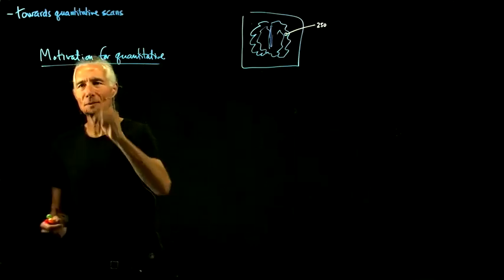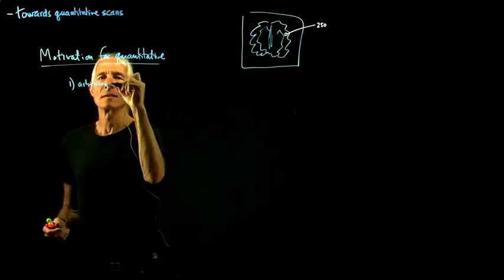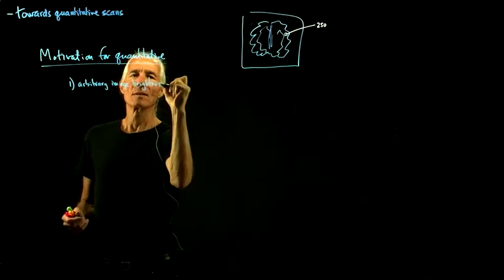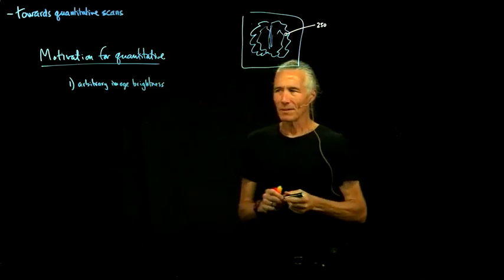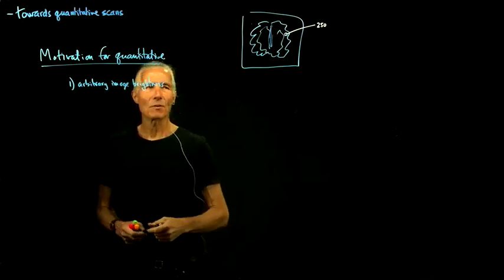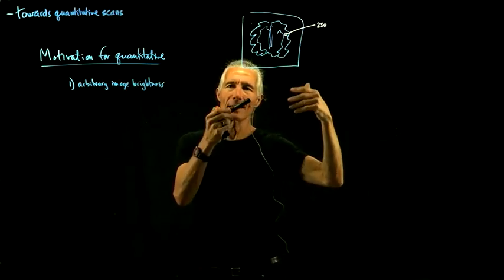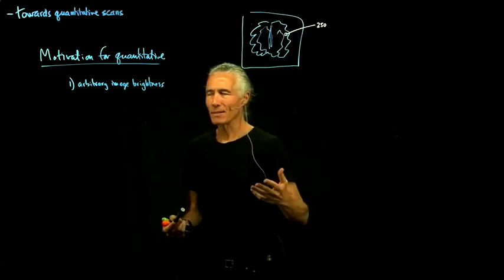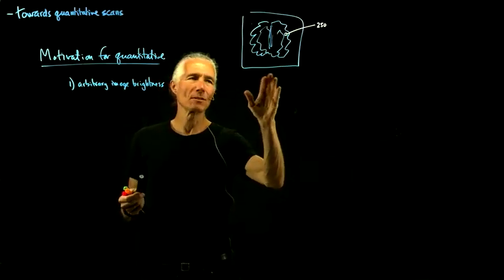So that's the first thing: you just have arbitrary image brightness numbers. It's a T1 weighted scan, so it's going to be weighted by T1, but it doesn't tell you what T1 actually is. So if you're comparing to another scanner or a scan on a different day, you have to normalize things and make certain assumptions about the contrast in order to make some comparison. And that's how most research is done. Like 99.9% of research is done that way.